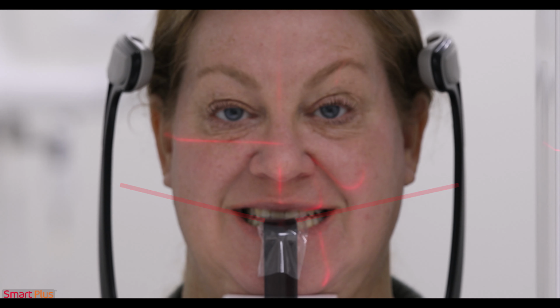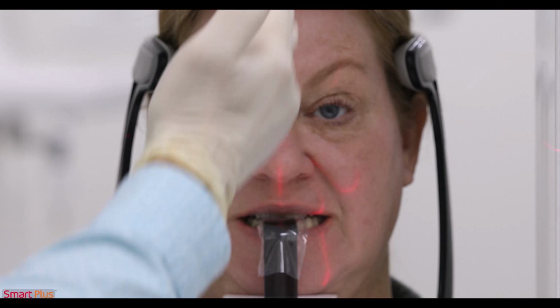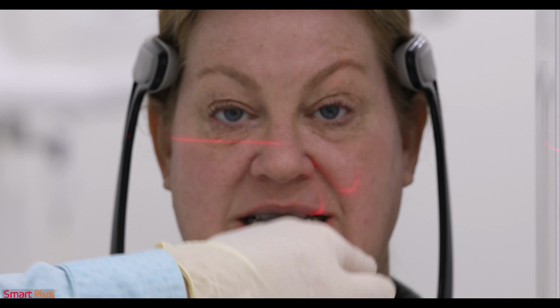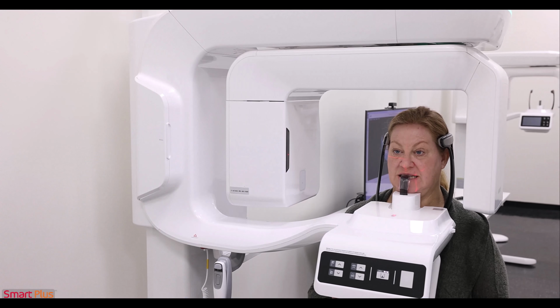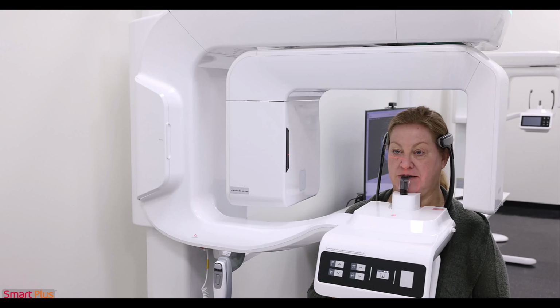Next, I'm going to go ahead and close my temple supports by clicking on the button here. Temple supports close, double check my mid-sagittal beam, and lastly we have our canine light. You can see it shining on the left side of the patient here. To adjust that canine beam, I can use our slide bar and move this anterior to posterior. Go ahead and smile really big for me. Perfect. All right, go ahead and relax your lips. We have our patient positioned.